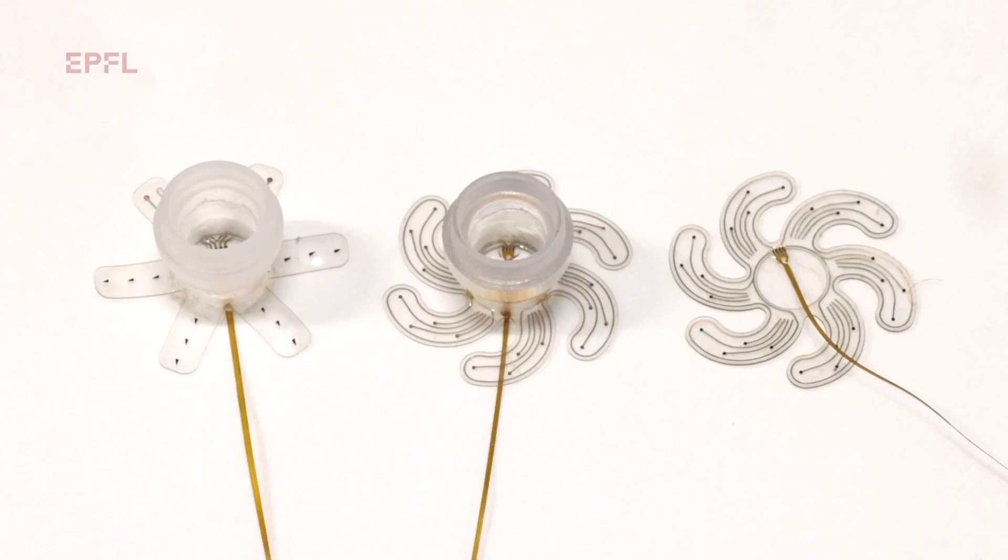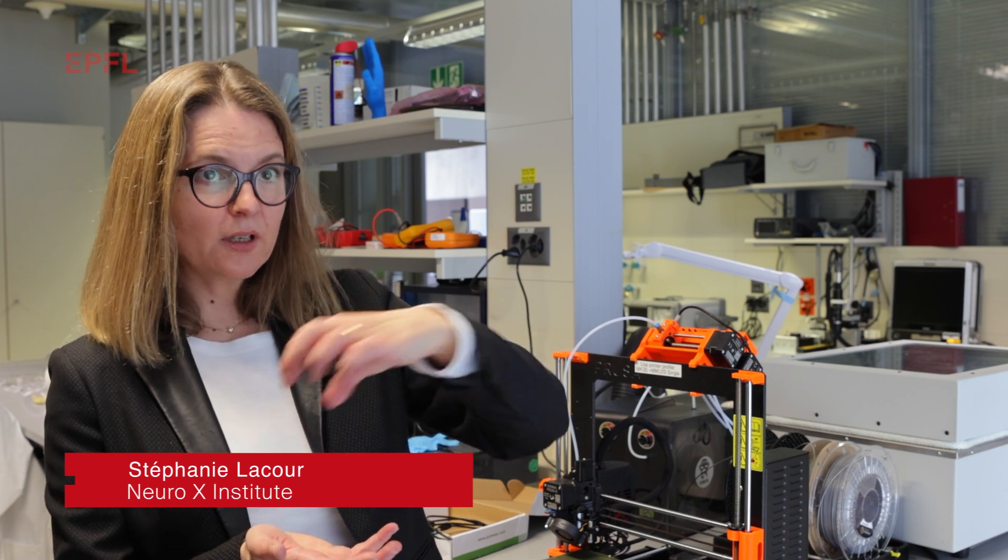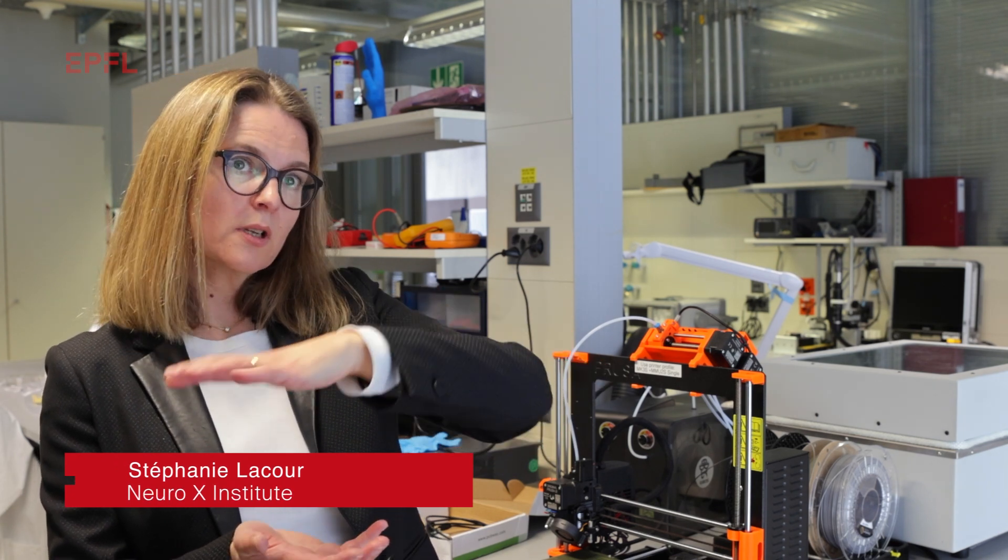Our very first prototype was really like a flower with straight legs, straight petals. When we made this device, we realized there was a lot of open space remaining at the surface of the brain. Therefore, we decided to engineer curvature into the arms of the flower, of the petal, so that we could have a larger surface coverage.